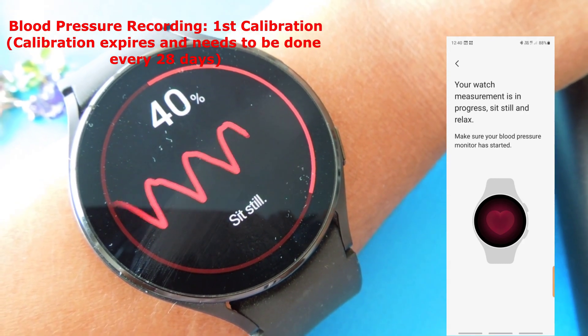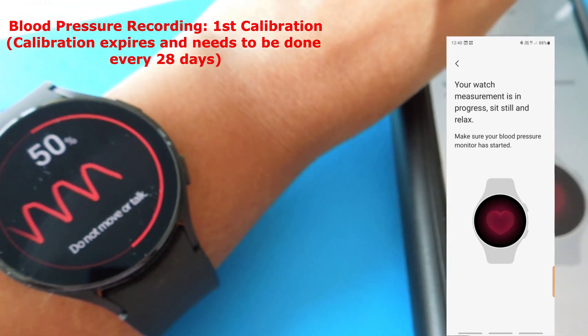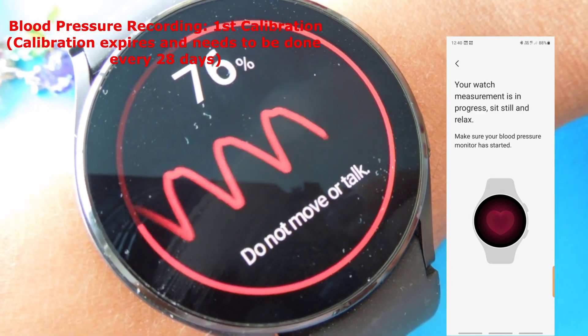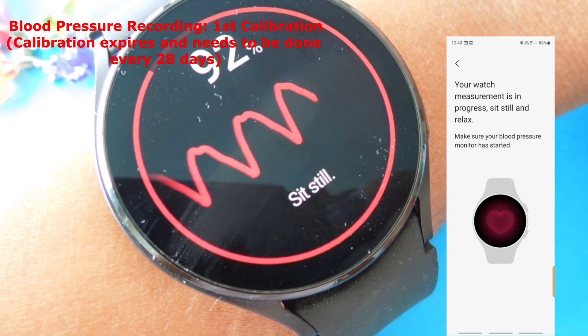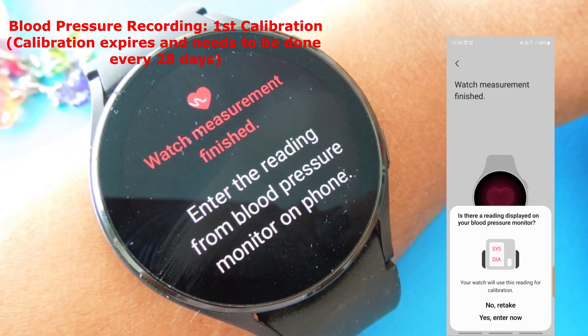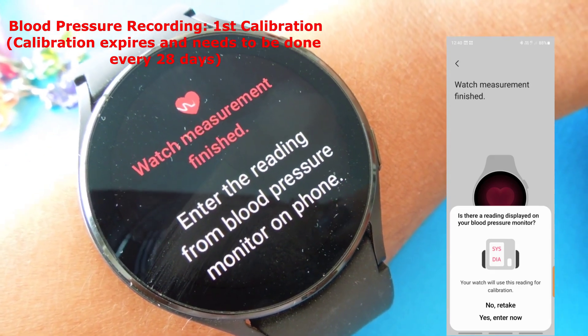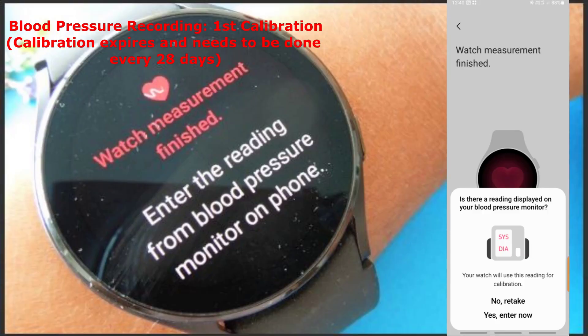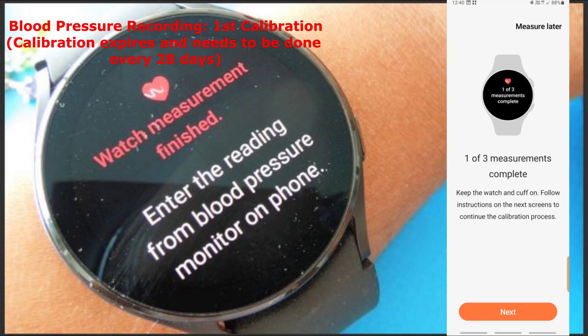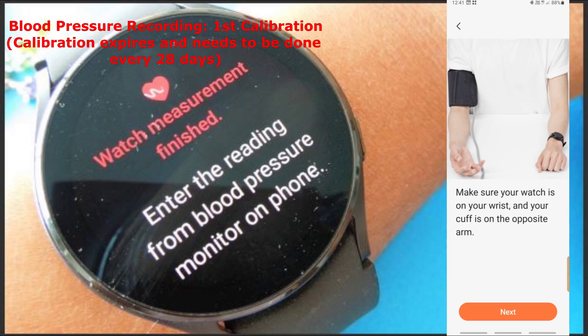The watch has started measuring. I've now completed the first of the three measurements. I keep the watch and cuff on and follow the instructions on the next screens to continue with the calibration process.